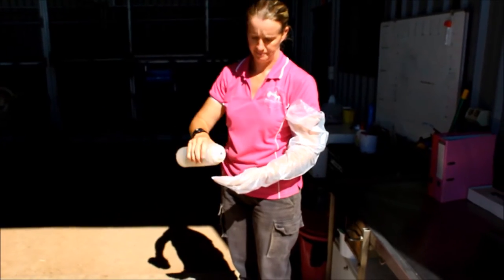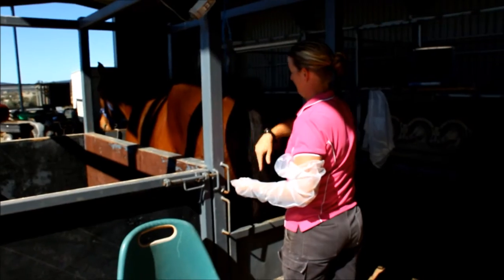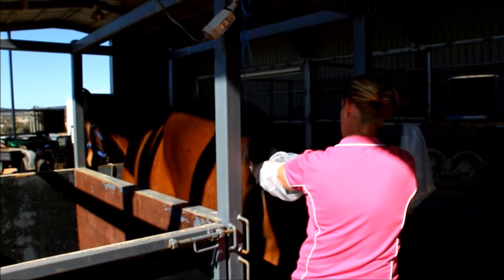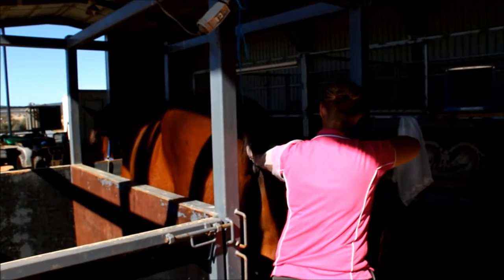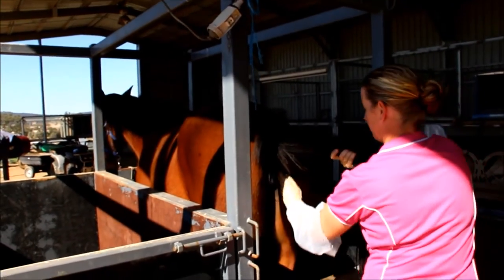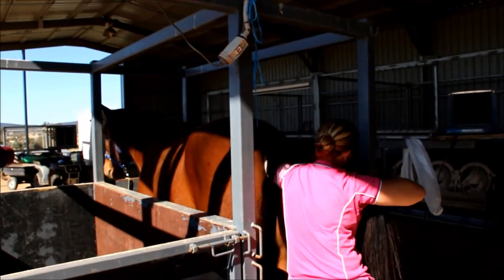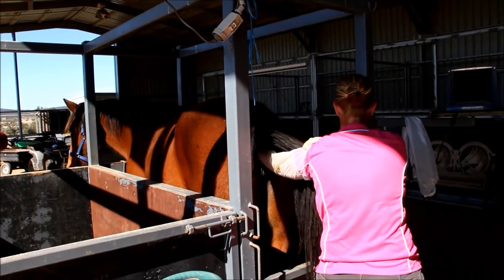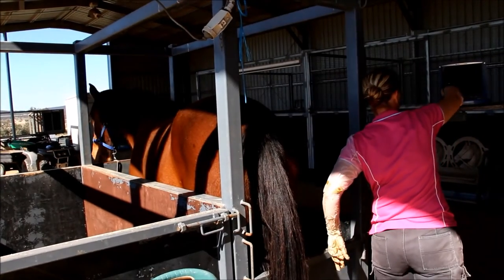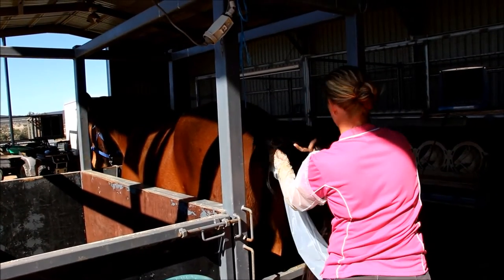This is done via rectal palpation first, so we have a feel of the reproductive tract, and then we apply an ultrasound probe into the rectum. The female reproductive tract in the horse runs very similar to the rectum, so it's a lot safer to rectally palpate and visualize the reproductive tract rather than going into the reproductive tract directly. Once your mare has been palpated, we have a look at both ovaries to see what size the follicles are, what her uterus feels like, how much oedema she has, and what her cervix is doing.